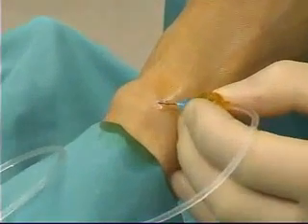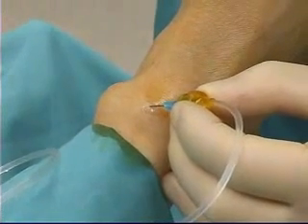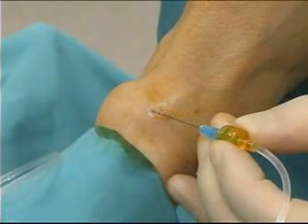Direct the needle medial and subcutaneously towards the anterior aspect of the medial malleolus and observe the skin wheel while injecting on the saphenous nerve subcutaneously and superficial to the fascia around the saphenous vein.